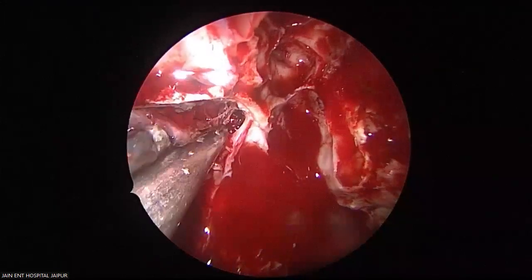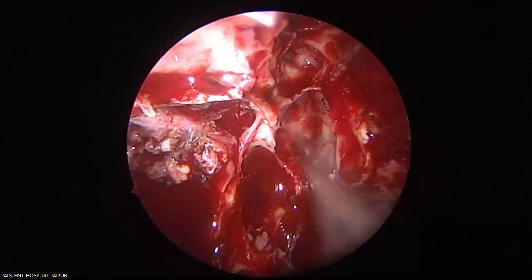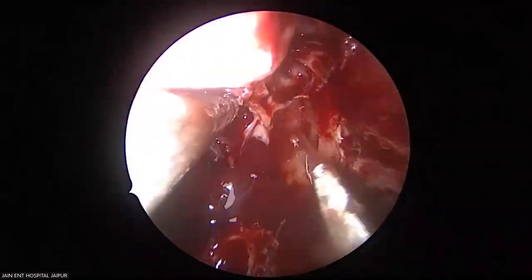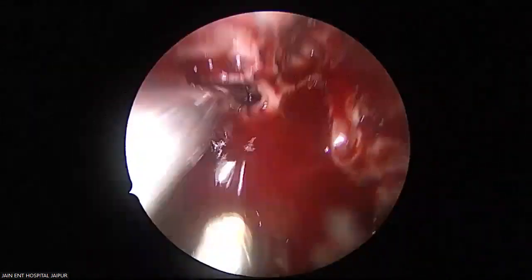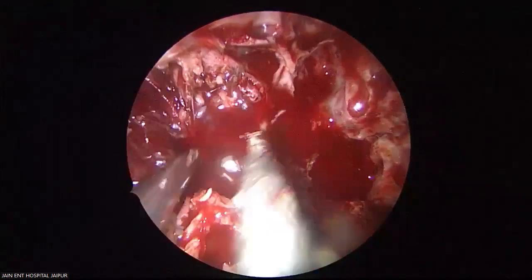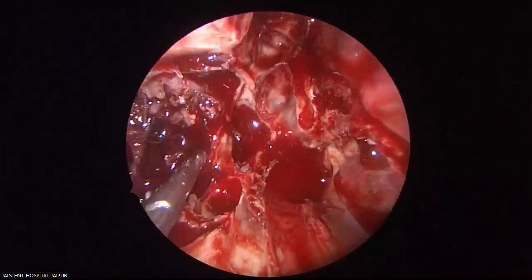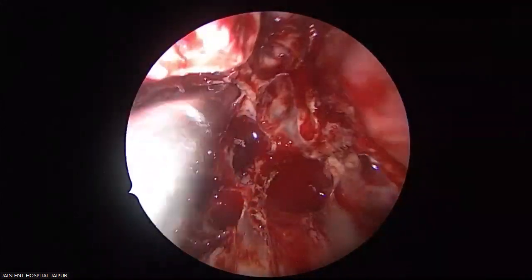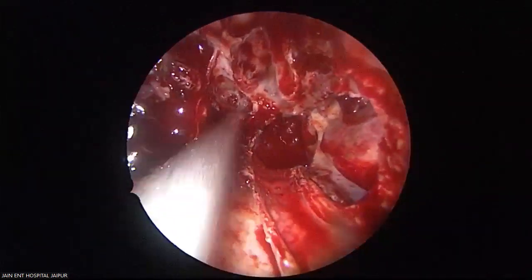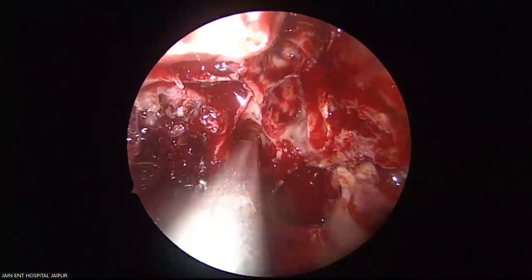Yeah, this is your superior orbital fissure. See that? Yeah, it's clear. Below is the V2. This is your superior orbital fissure, below is the V2. Now, here laterally, this is your infratemporal fossa. Now, give me one by one. See everywhere, no tumor. See the huge infratemporal component. We have removed it.